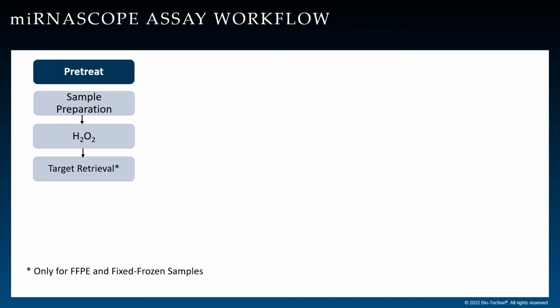FFPE and fixed frozen sections then require incubation in target retrieval buffer to recover RNAs that were cross-linked by overnight fixation. Hydrophobic barriers should not be applied to FFPE or fixed frozen sections until after target retrieval. Here there is an optional stopping point.